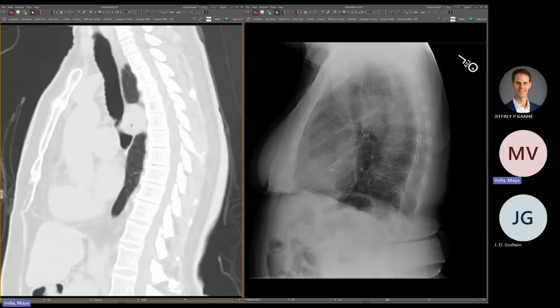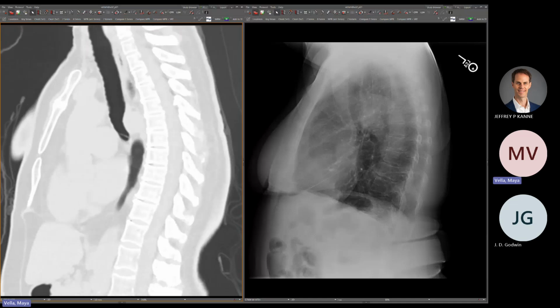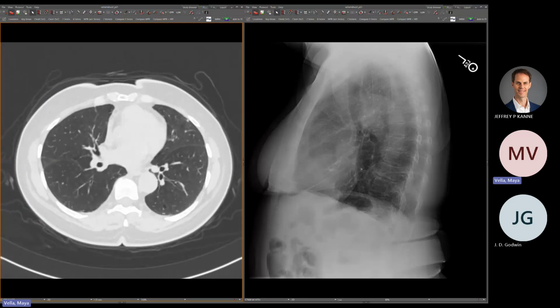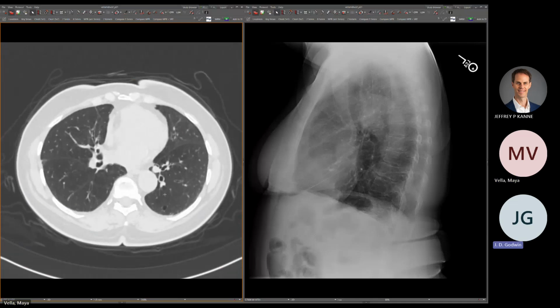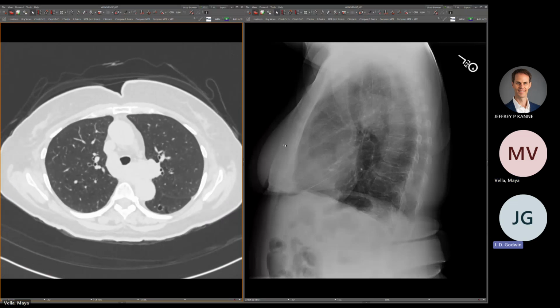But yeah, you're right. There was some bronchiectasis in that left lower lobe as well. But yeah, trachea itself looked okay. Sort of focally posterior in the left lower lobe, so maybe from some old infection or something. Very cool. On the lateral view, you can see this big blob that you first pointed out. It flows into the left pulmonary artery, going over the top of the bronchus down here. Yeah, cool.